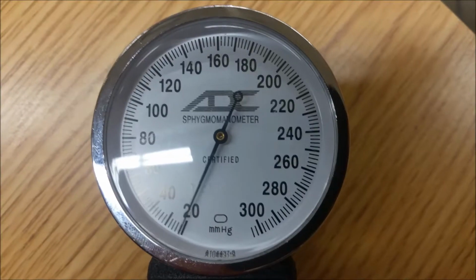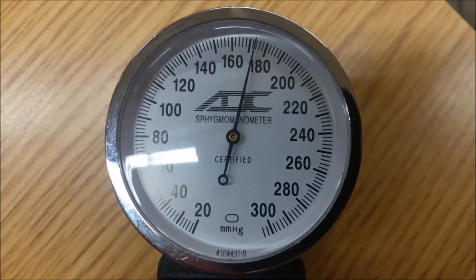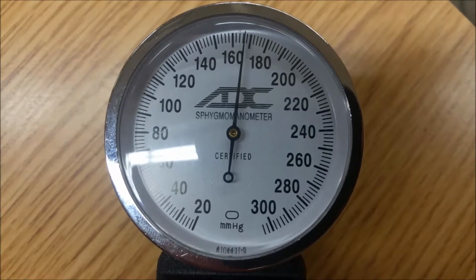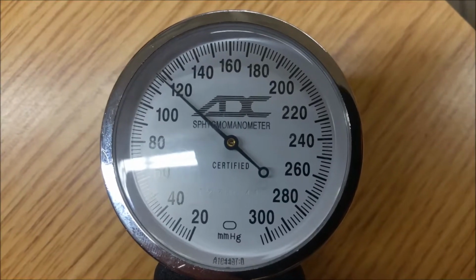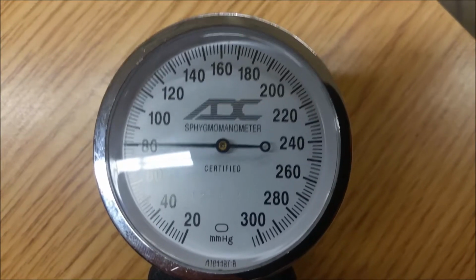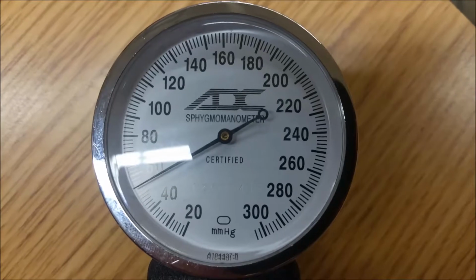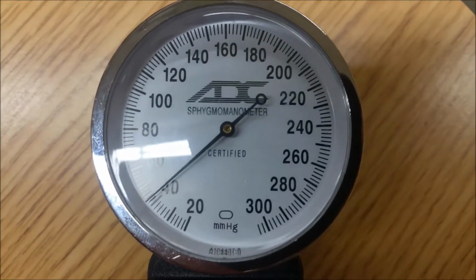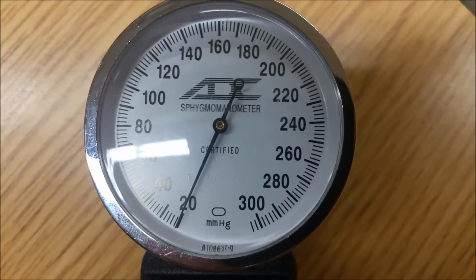Pump to inflate the cuff to approximately 160 through 180 millimeters of mercury. After reaching this value, slowly release the air. Listen for the first Korotkoff, or thump, sound. This is the systolic blood pressure. Listen for the last Korotkoff sound. This is the diastolic blood pressure.